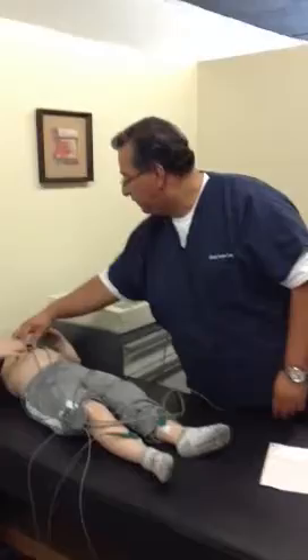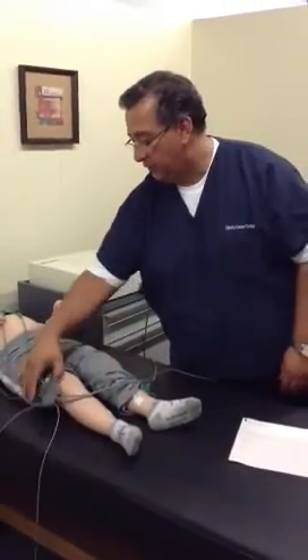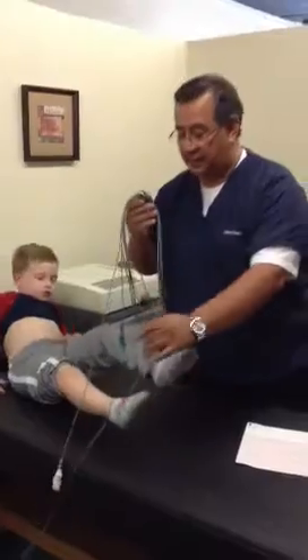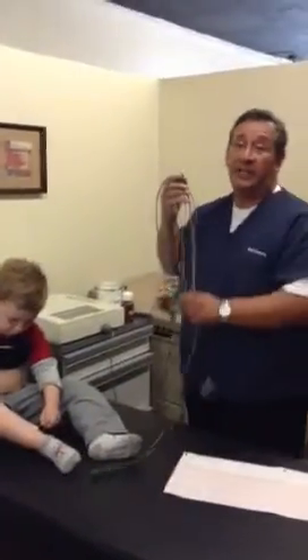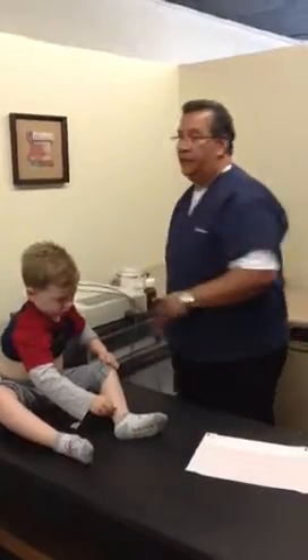At that point, you would take all the electrodes off and help the patient off the table. Remember that if your patient is male and there's a lot of hair, you're going to have to deal with that hair — whether it's pulling the hair aside to get the electrodes to stick or shaving. If it's a female patient and you need to get those electrodes under the breasts, lift the breasts up with the back of your hand, not the cup of your hand — move it upward and then place the electrodes underneath. Body fluids like sweat can interfere with the electrode sticking, so you might have to wipe that off. If the patient has lotion, you'll have to prep it with alcohol and cotton to get rid of some of that body oil or lotion.